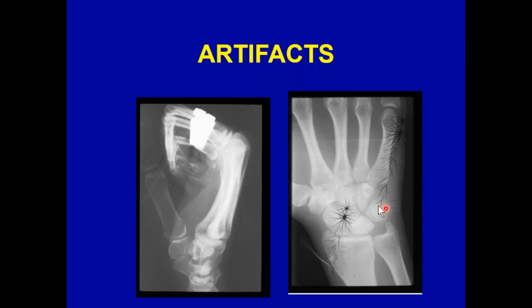Rings, if they don't come off, that's fine if the problem is in the thumb, but if the problem is in the fourth left finger where most of the wedding rings are, that has to come off if that's where the area of interest is, or if that's where the bruise is, because that's where you're going to put your X of your central ray.